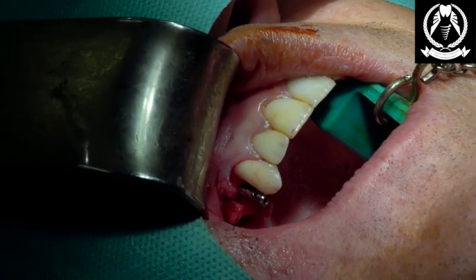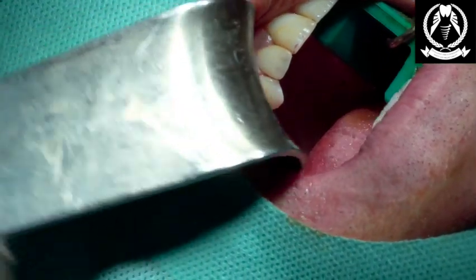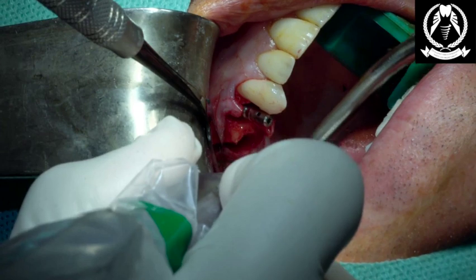Correction, what was the implant again? 4.5 by 10. Okay, we're going to go first marking at 7. So I'm just going to widen that osteotomy bit. How are we doing, Alan? Okay, second drill. Open a little bit wider, Alan.